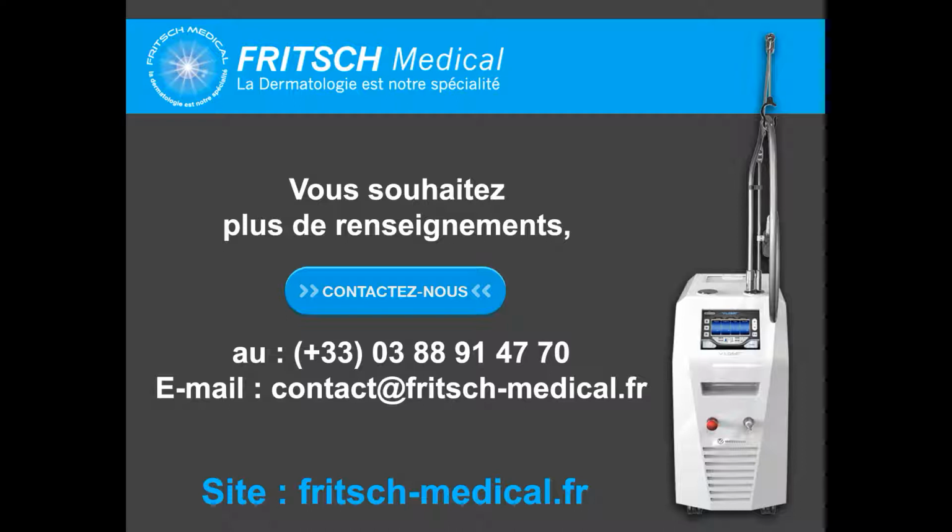For redness of the face, and for the telangiectasia of the nose, you normally have to use the 1064. Be careful: use the small handpiece, the small spot, maybe 2 if possible. The 3 and 5 are maybe more dangerous, because the nose is very specific, and it's very common to have some crust and after that a skin necrosis. And for nose telangiectasia, only one shot, not a second pass, because it's too dangerous and could induce a scar.